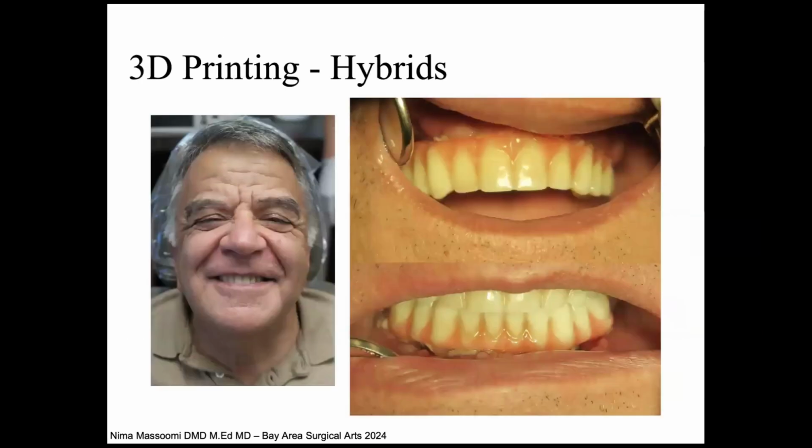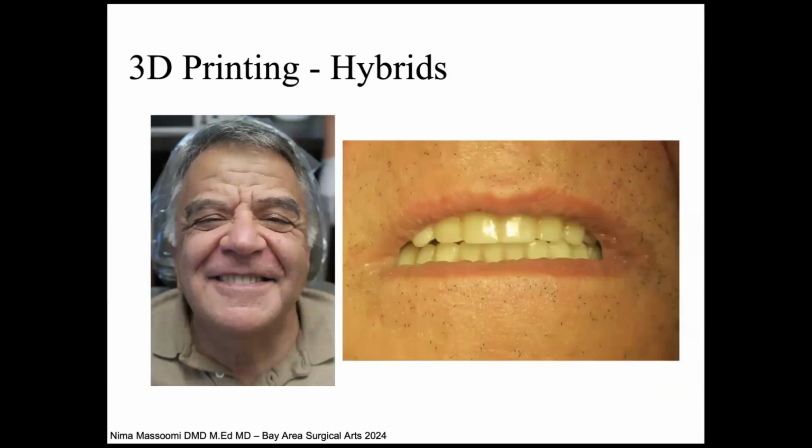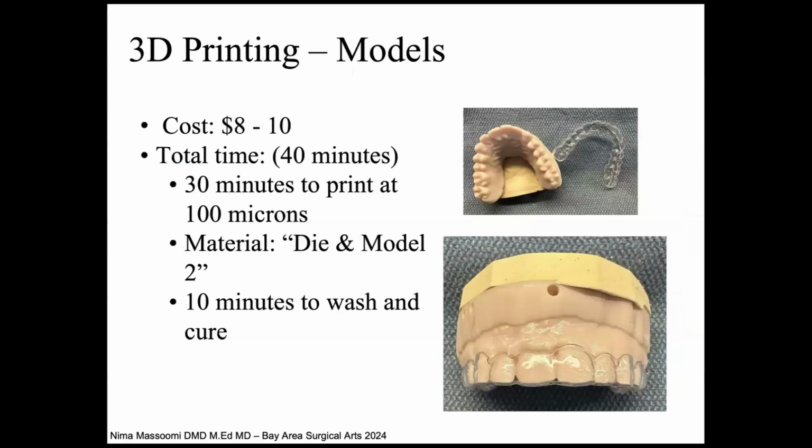And this is the case that we did recently. This gentleman came in with a 2-jaw hybrid with an upper and lower 3D printed hybrid prosthesis. We're printing models now because lots of times when patients come in, if we can't do the immediate implants, we've got to have an Essex, right? So I would have the general dentist make an Essex. I don't even have to do that anymore. So they don't have to waste all that money for an Essex that they may never end up using.